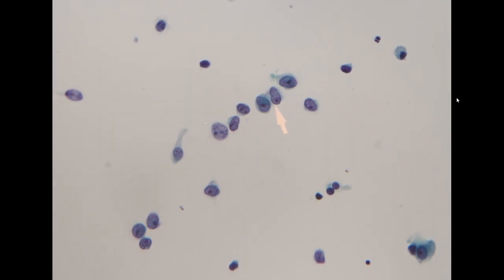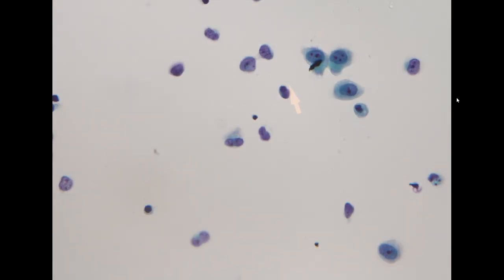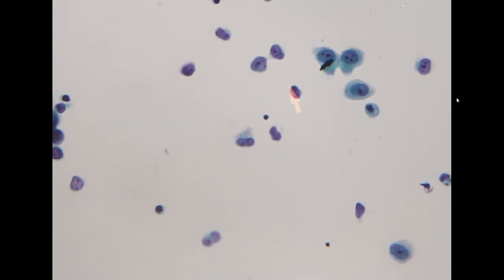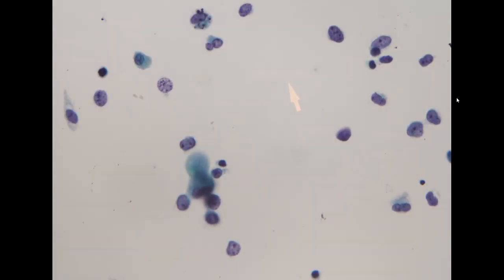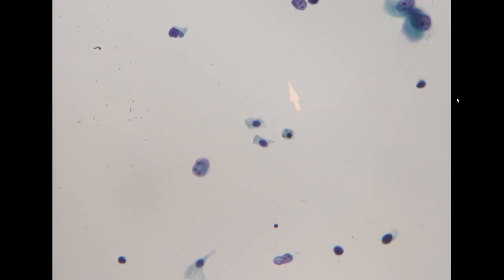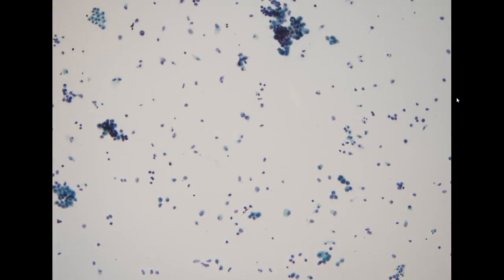However, the nuclear contour is still irregular. You see the nucleus is not rounded, they are elongated, angulated. There are some notches around the membrane, so this is positive for urothelial carcinoma. And because the clinician already sees there is a tumor in the ureter, it is also compatible with clinical observation. In the background, we see a lot of these single cells compatible with high-grade urothelial carcinoma, but most of the larger fragments are actually benign urothelial.